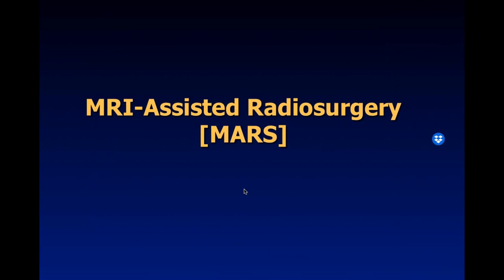So what is MARS? What is MRI-assisted radiosurgery? And I coined this term, and we've now published on it, to describe utilizing a surgically ablative approach to achieve a PSA consistent with what we would expect following radical prostatectomy. And what we would be aiming to demonstrate is that we can treat the intraprostatic dominant lesion and ablate the prostate utilizing brachytherapy in a radiosurgical approach. So I'll describe a little bit of that.